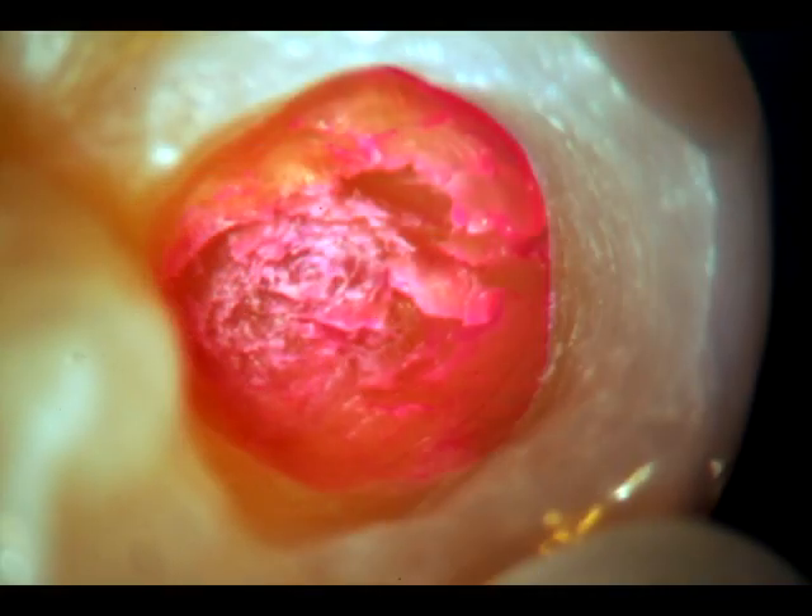According to Dr. Clark, there are other alternatives — the use of magnification, special burrs, equipment, and stronger materials that can be used as a preventative treatment. Now that we have shown the limitations of traditional painted-on sealants, we will go to a live patient treatment to demonstrate a much more permanent preventive treatment for occlusal decay. We call this the minimally invasive composite technique.